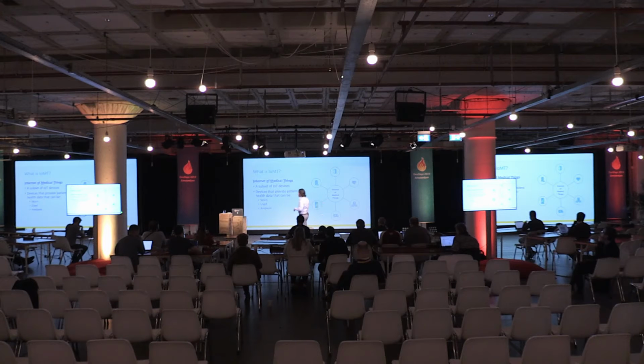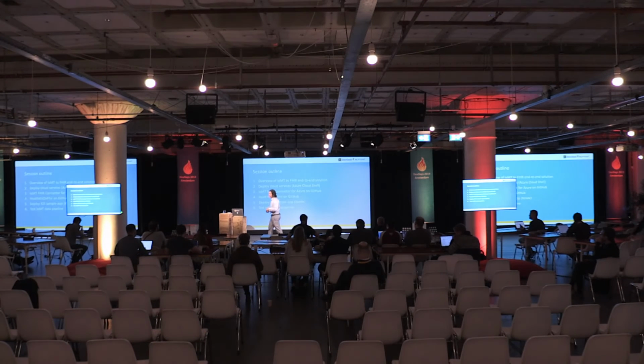I won't spend too much time on this slide because Dustin kind of went over it before, but what is IoMT? It's the Internet of Medical Things. It's a subset of IoT devices. They collect patient data, things you can wear, like wearables, Bluetooth scales, Bluetooth thermometers, things like that. Sometimes there are sensors in hospital rooms where, as you walk by, they can get your heart rate or blood pressure. Like I said, I'm not going to spend much time on this slide.